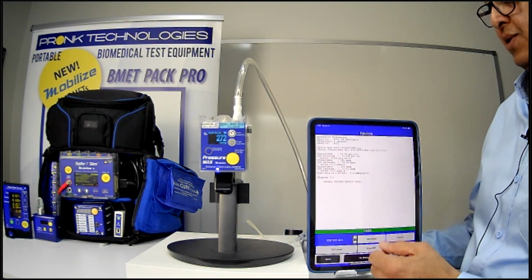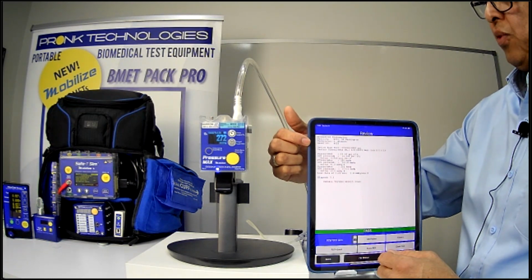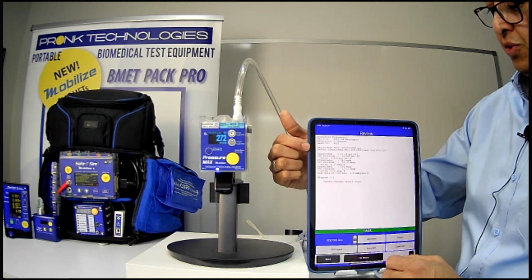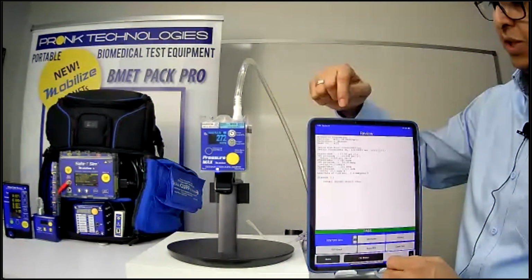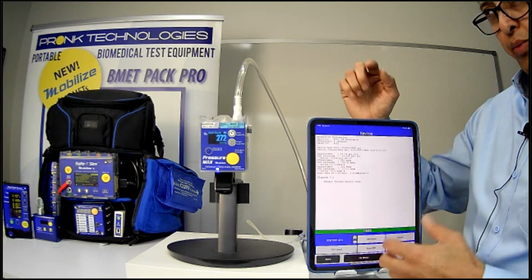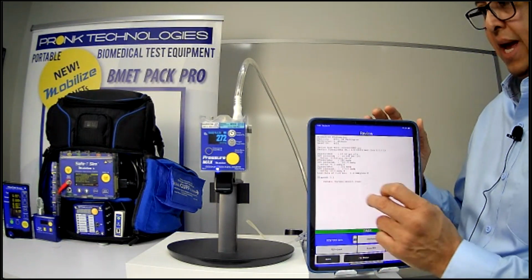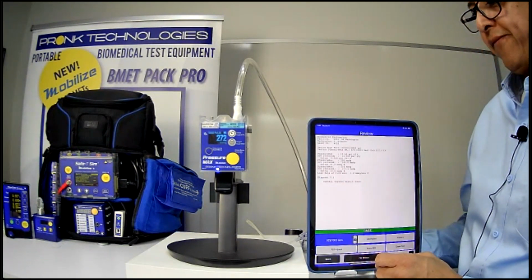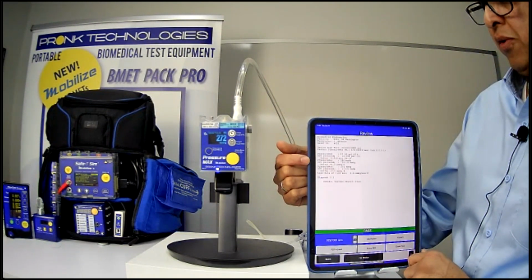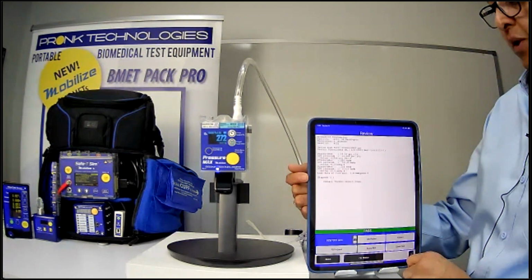We just did a basic test here. So at the top, you have your header information of what our facility, our organization is. You have the test equipment that was utilized, not only the test equipment, but the serial number and the date the test equipment was calibrated, which is very important. You want to know when the test equipment was calibrated, so why not have it on the report? So that's important information to have on there. And then on the far left here, you can see all the test points that we tested with the results and the deltas that we saw.